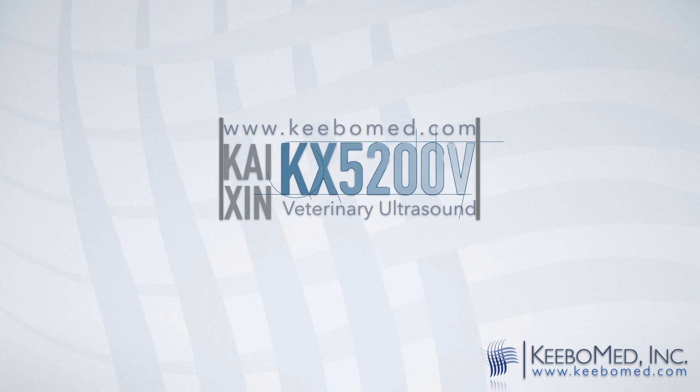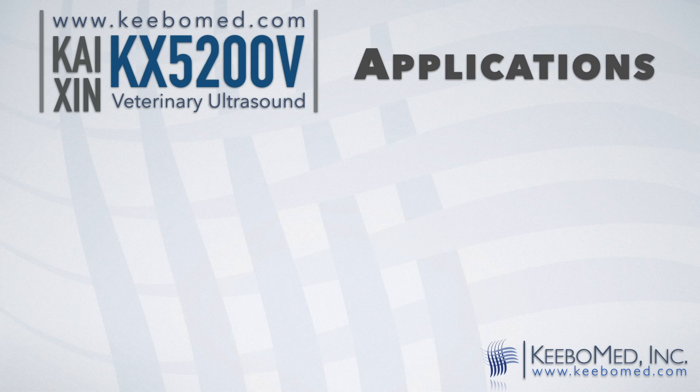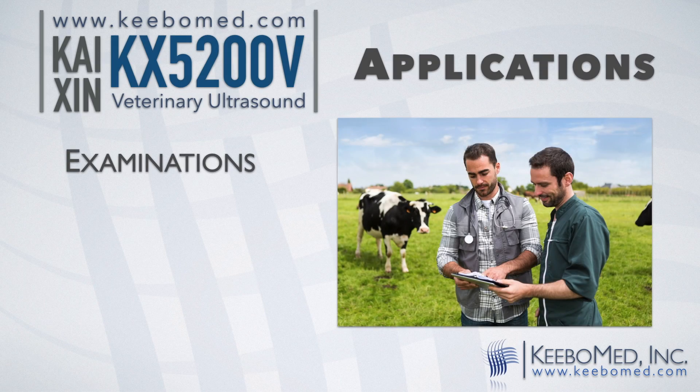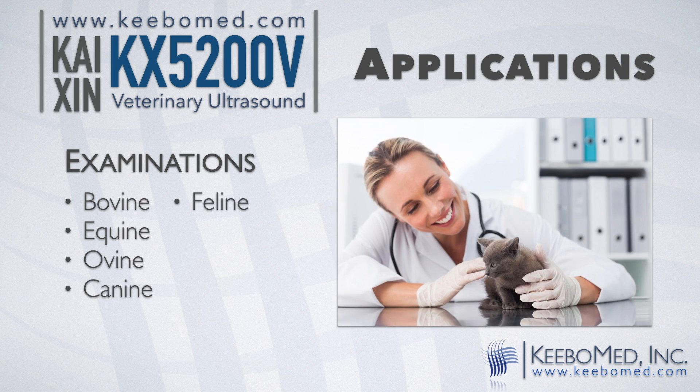Here are some additional details of the KX5200V. The KX5200V is designed for many veterinary examinations such as bovine, equine, ovine, canine, feline, goat, and llama.